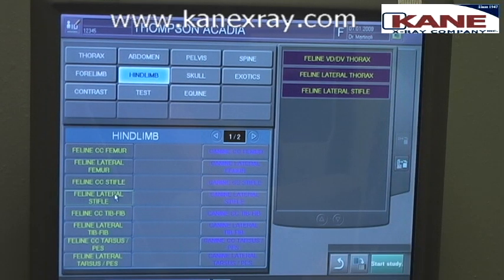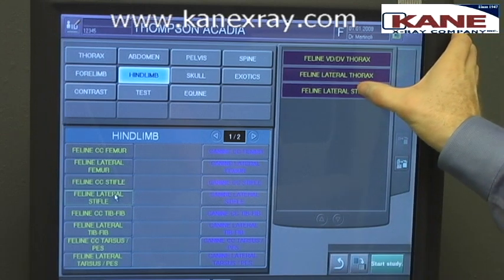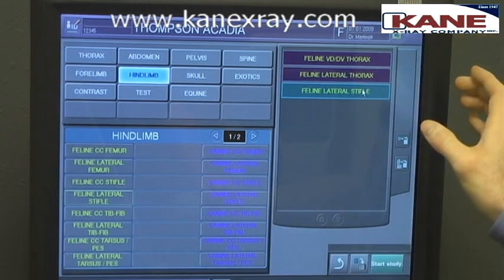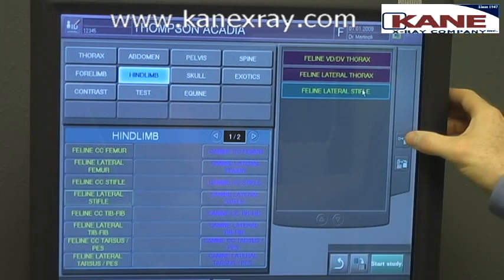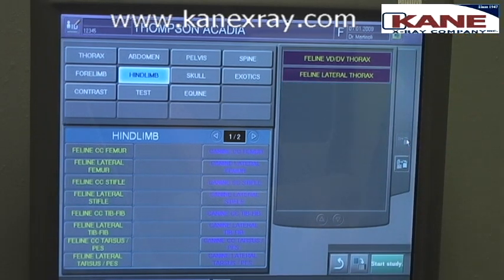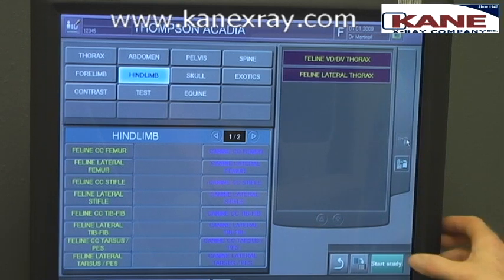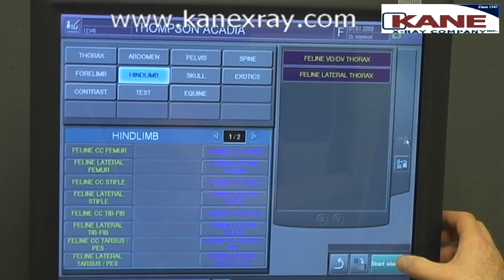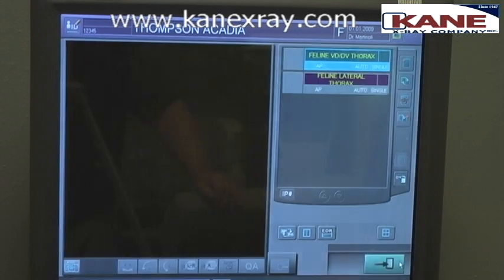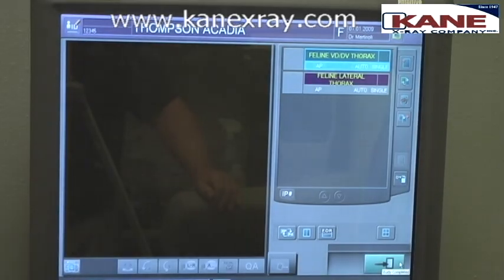If we added the stifle view in error, we could highlight that menu, send it to the trash can, and delete that study. Once we have all of our menus on the screen, we're ready to hit start study and move on to taking x-rays and inserting cassettes.